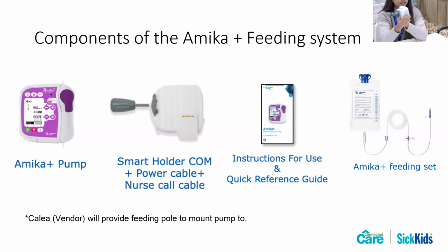To disconnect, on the side here is a gray piece. And so you would just press on this gray piece like here. It's really hard to show, but we're going to press on this gray piece and slide it off. So essentially you just slide it off, and that's how you undock the Amika Plus.